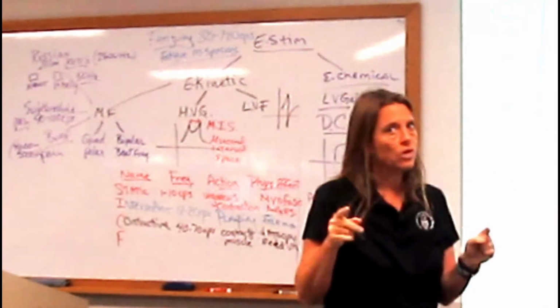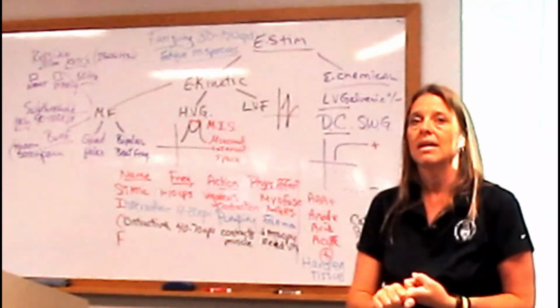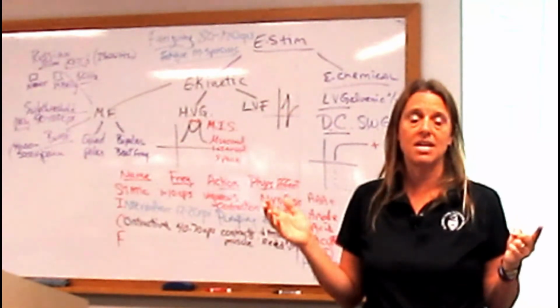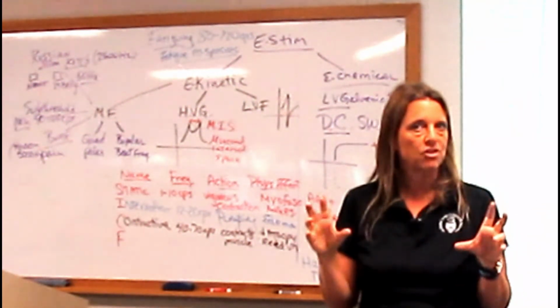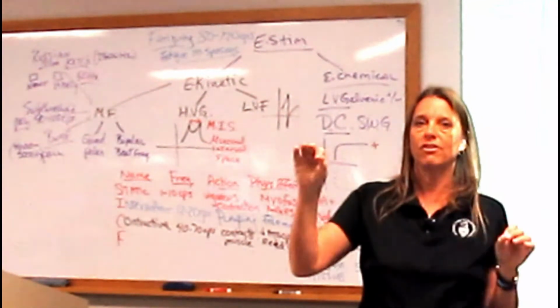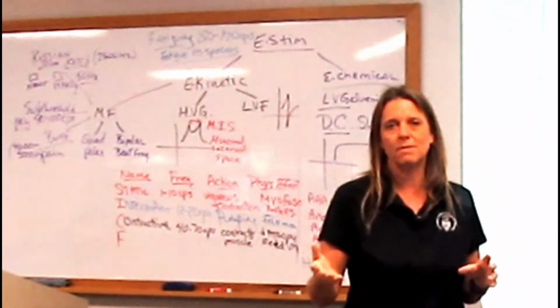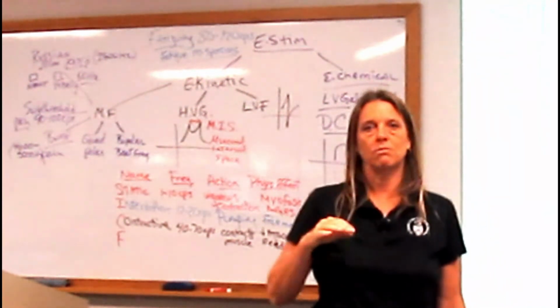Now, words that you can't get confused are super important to understand. Intensity is like the loudness, the volume. The intensity is the amplitude. So sometimes you'll see the words amplitude modulation. That means vectoring. Sometimes you'll see the word scan. That generally means vectoring if it's changing the amperes or the intensity. So when I talk to my students, it's like punching me hard or soft. It's not punching me faster or slower.